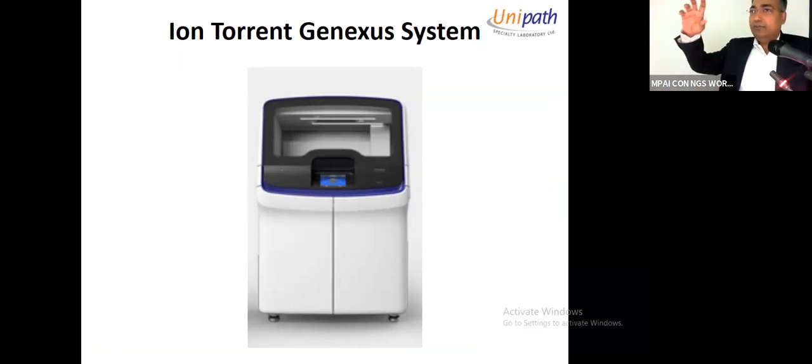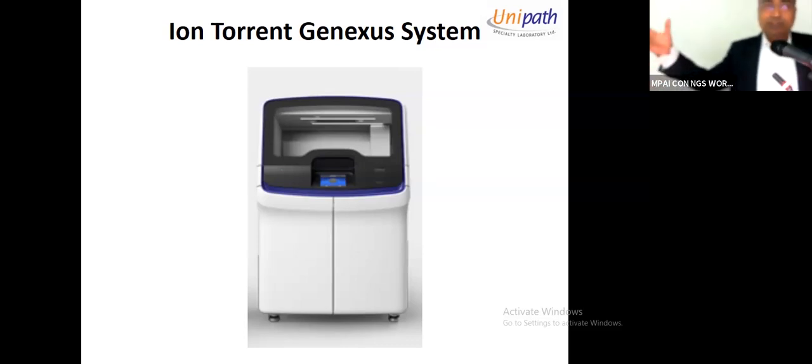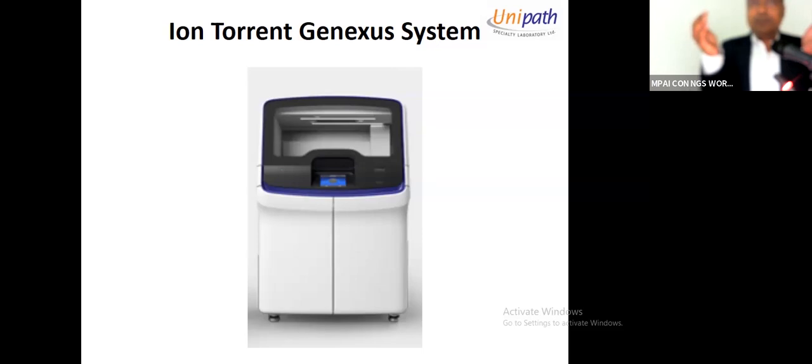As we have been discussing from morning, you need to prepare the library, you have to extract DNA, prepare library, load it to the sequencer, get the results, and then get your data analysis going. But here we have a system where everything is combined, and what we're realizing is extracting the sample and loading it into the sequencer. Of course, whatever sample goes in has to be of very high quality, because there is no other QC step involved.